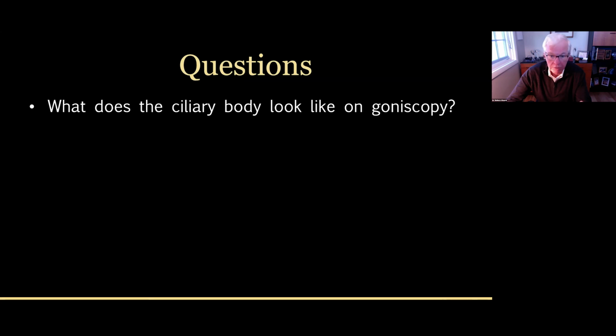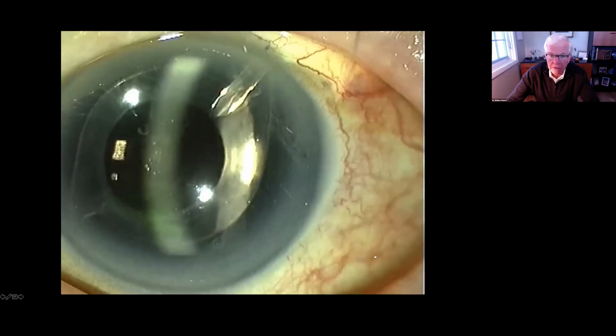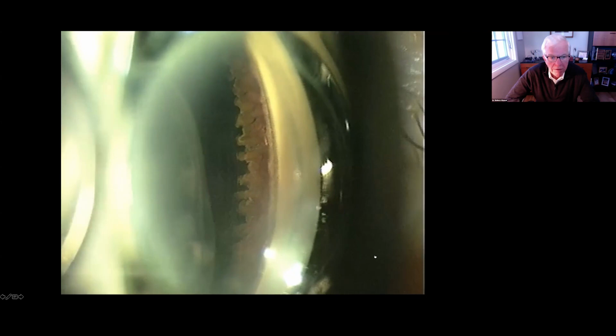This is a patient who was pseudophakic and had a tube shunt done, as you can see there, and then fell and ejected their iris out through their phaco wound. But it gives us a great view of the ciliary body. The ciliary body in a normal eye is hidden by the iris. So you would see it here, and this is traumatic aniridia, of course. You could see it in congenital aniridia. This is a spectacular view.